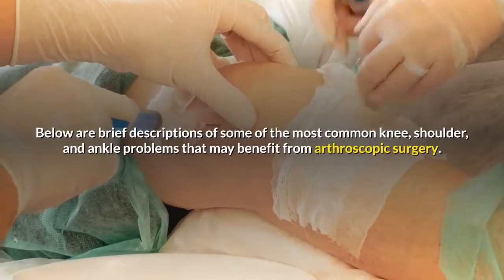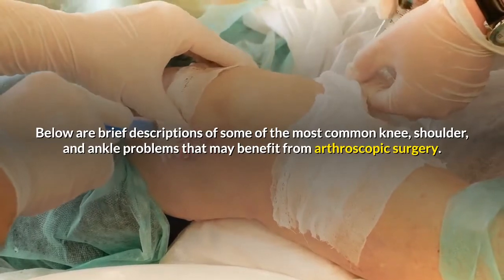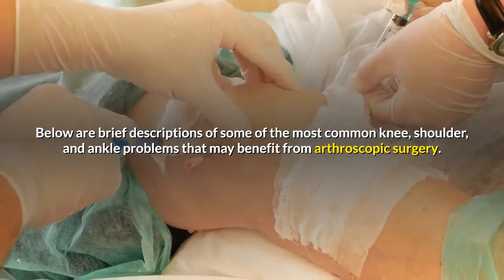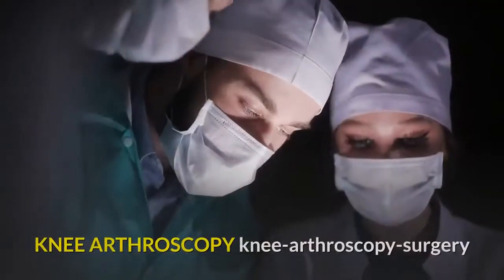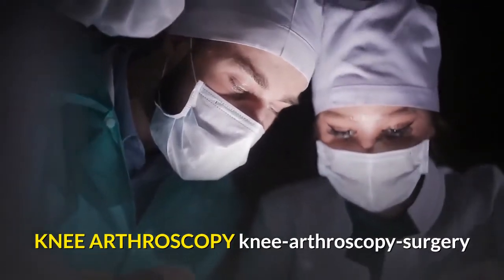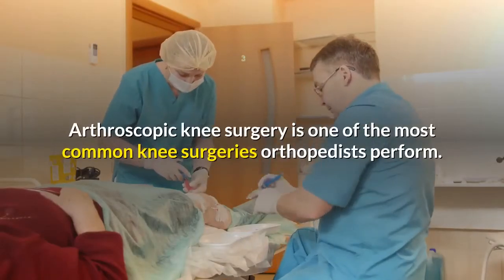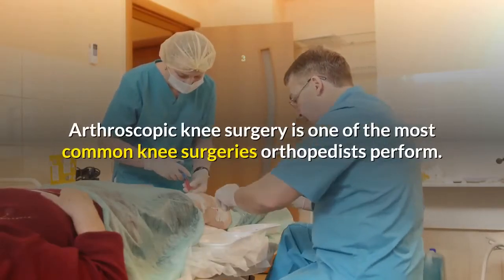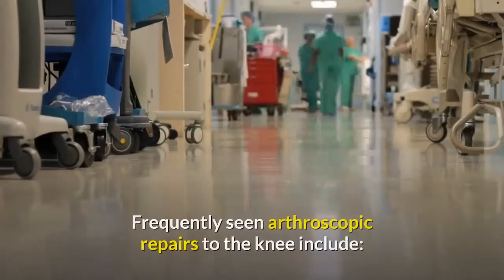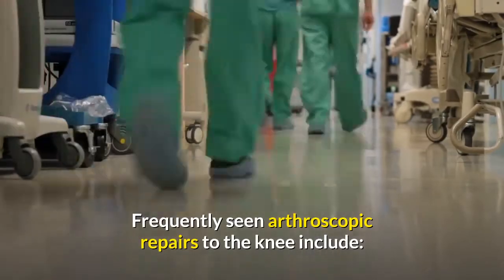Below are brief descriptions of some of the most common knee, shoulder, and ankle problems that may benefit from arthroscopic surgery. Arthroscopic knee surgery is one of the most common knee surgeries orthopedists perform. Frequently seen arthroscopic repairs to the knee include the following conditions.